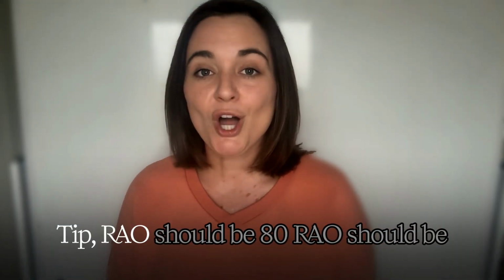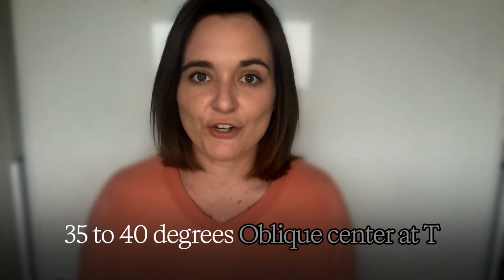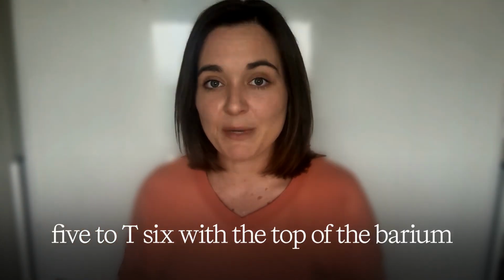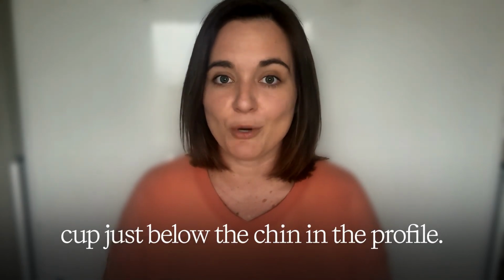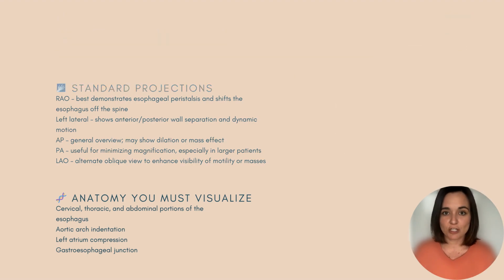Positioning tip: RAO should be 35 to 40 degrees oblique, center at T5 to T6, with the top of the barium cup just below the chin in the profile. Here's the anatomy you must visualize: the cervical, thoracic, and abdominal portions of the esophagus, the aortic arch indentation, left atrium compression, gastroesophageal junction.